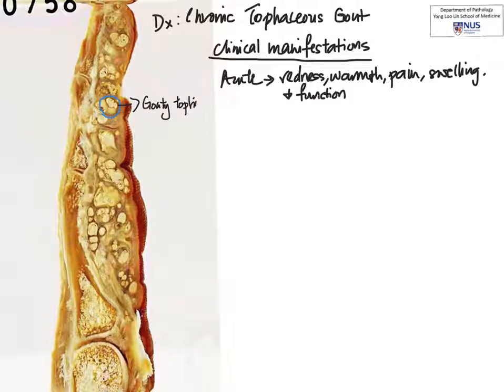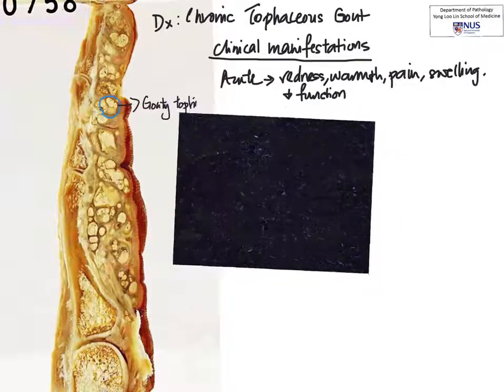Clinically, what the doctors would do, especially if there is a joint effusion because of acute gouty arthritis, is that usually there will be a lot of fluid in the joint space which they will aspirate with a needle and send to the pathologist for examination. We look under polarized light microscopy — which is why you can see the whole background here is dark — for these needle-shaped crystals. These are all uric acid crystals, and if you use a special filter, we can actually see that they are negatively birefringent. So this clinches the diagnosis of gout.